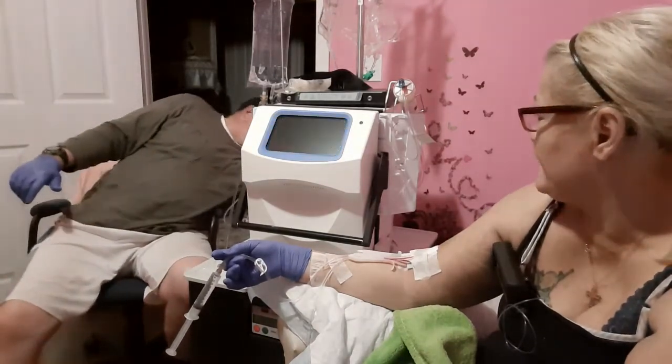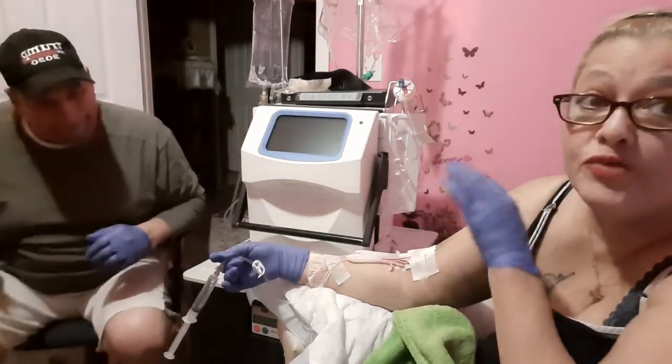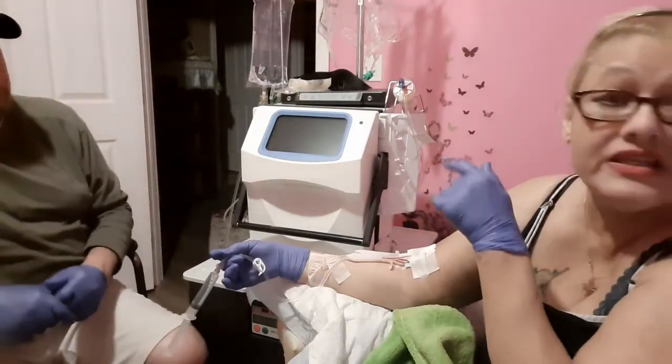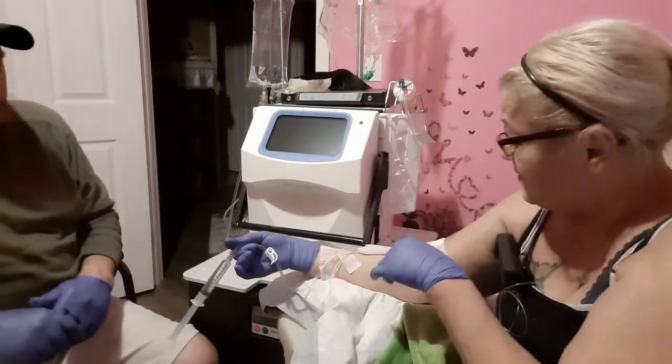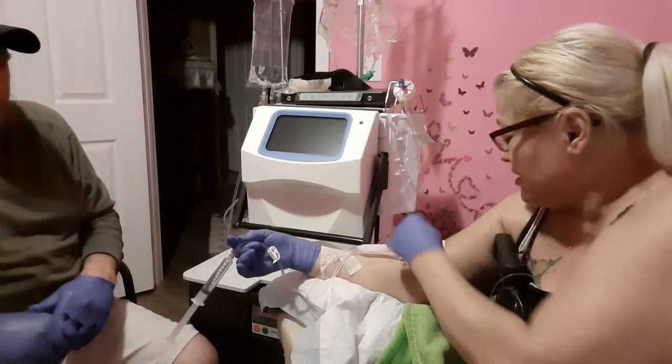So that's done. He'll break it down in a minute, but right now he's got to help me with the syringes. So he's going to get his sharp container next to him, and we're going to start removing these needles.